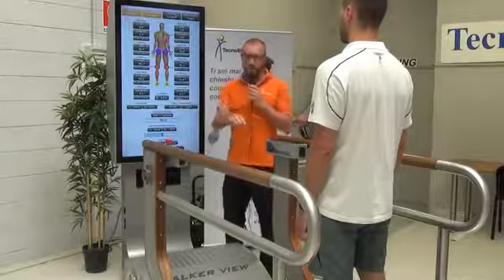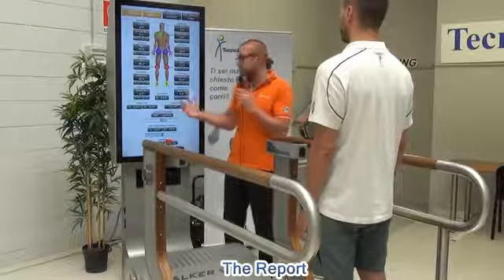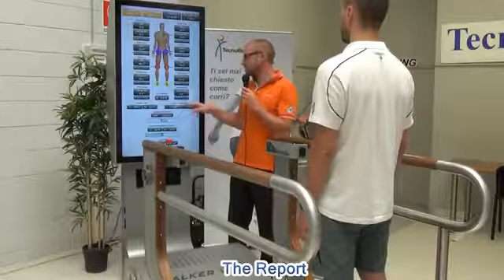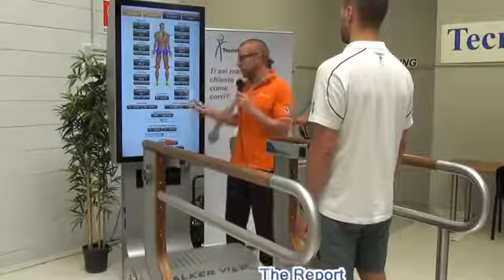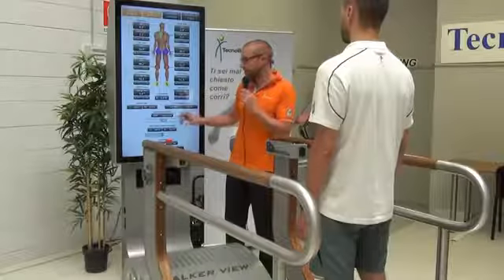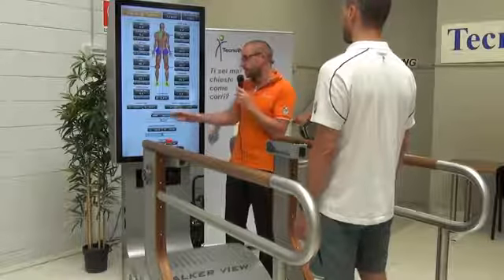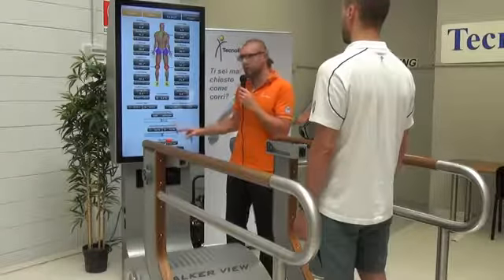As well, we have the 8 load cells under the roll that provide other kinds of information after the test. So it's about the load symmetry, the contact time between left and right lower limbs. Very important is the center of gravity displacement, so the movement of the center of gravity on the frontal plane. And then you can see over here other kinds of data in which you can see normative data, so you can have straight away a visual input if your patient or user is inside this normative data. Normative data about the average step cycle time, about the step length, and the coefficient of variation of the step length.